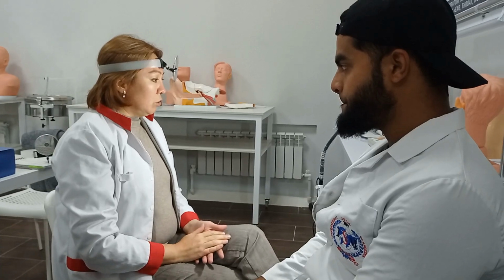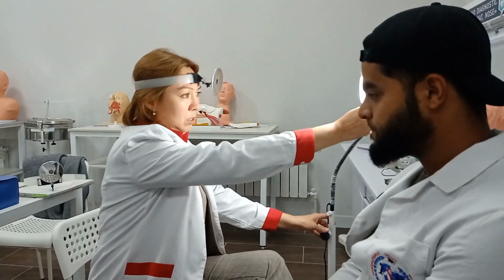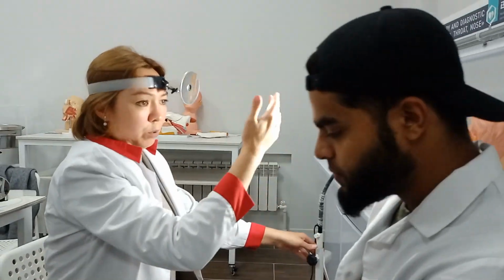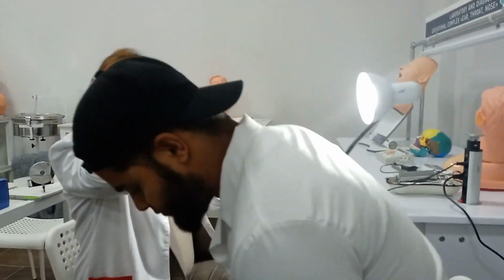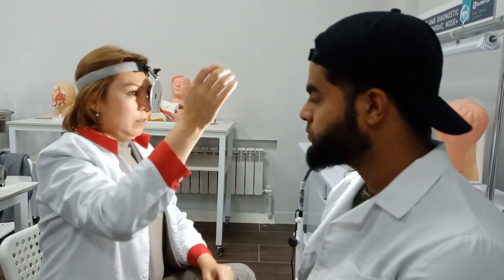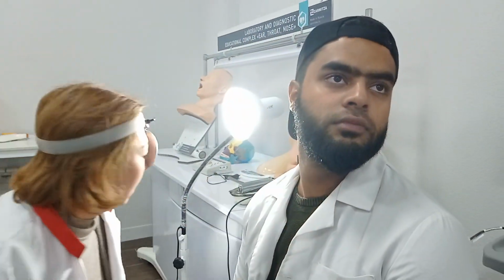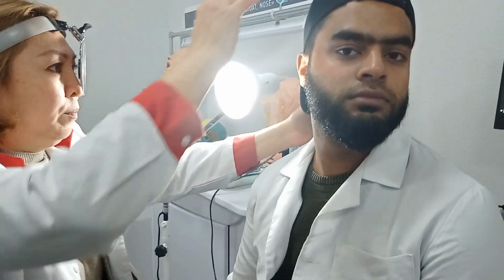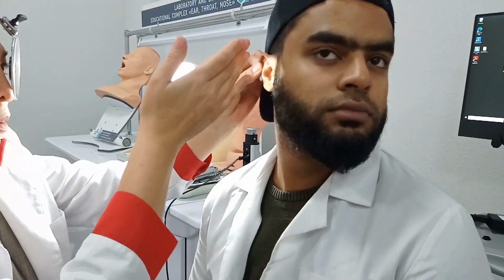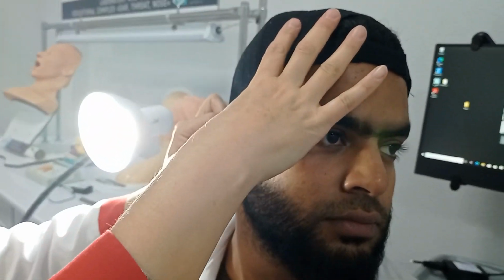Then otoscopy. You see the patient sitting, the ear located on the right side of the patient, opposite the examiner. So we need in these reflections this head mirror for the reflections. You turn his head, and you pull the pinna upward and backward. And by this, you can help yourself with opening the canal.